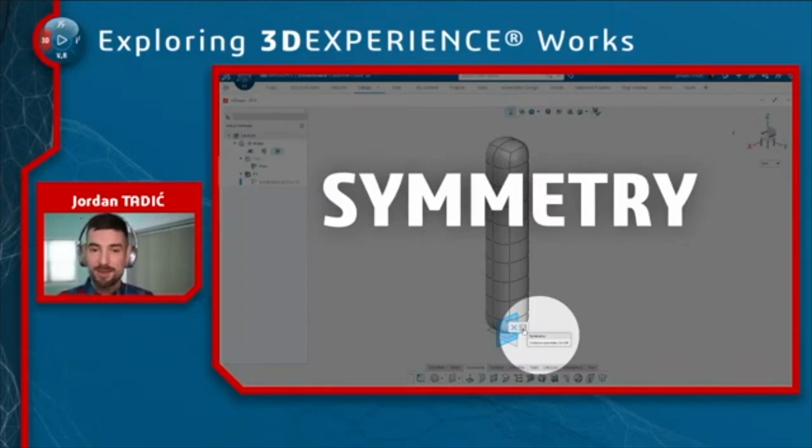Now, just like SolidWorks, one of the best things about the SolidWorks user interface is that the context toolbar is always popping up, recommending, based on what you selected, the next step that you might consider in the modeling process.